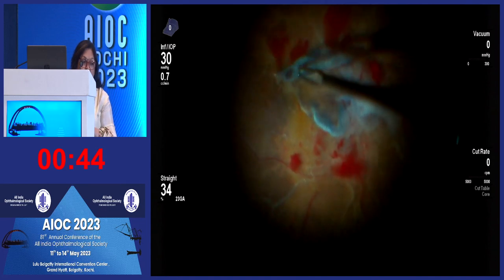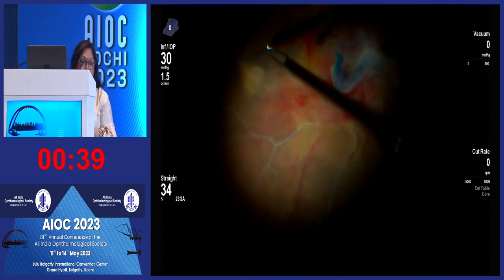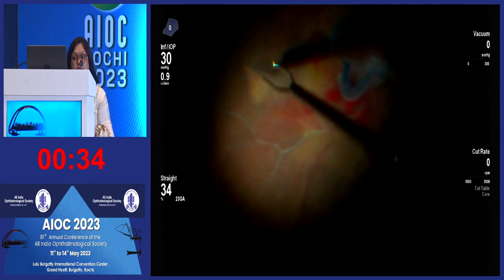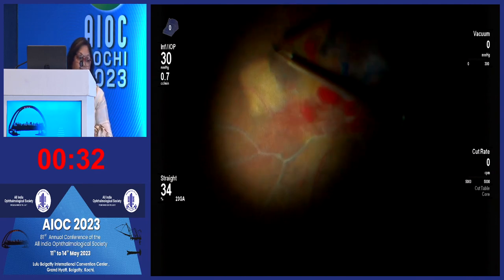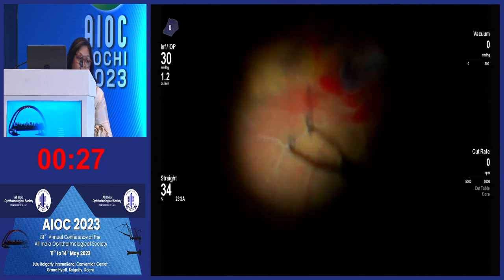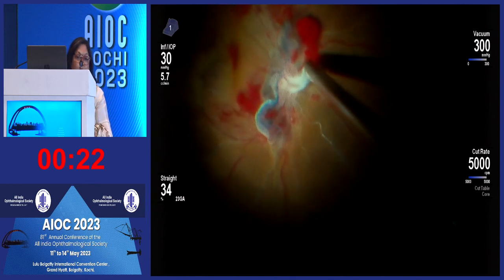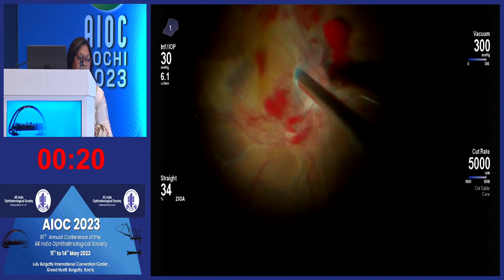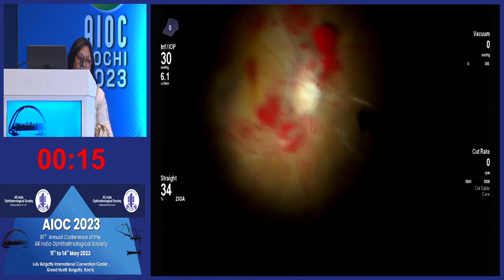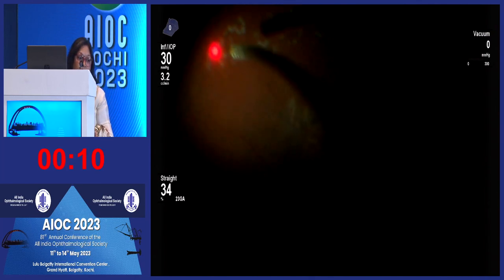The entire retina was very, very atrophic and all the vessels were extremely sclerosed. So once you come here and once you finish the ILM peel, it's important to trim this off on the disc and not try and peel it further. Sometimes a small part of the ILM can be left at the fovea, like an ILM sparing the fovea kind of a thing, so that you do not de-roof the fovea at all in such cases. Finally, an endo laser is done in these patients and silicone oil is put.